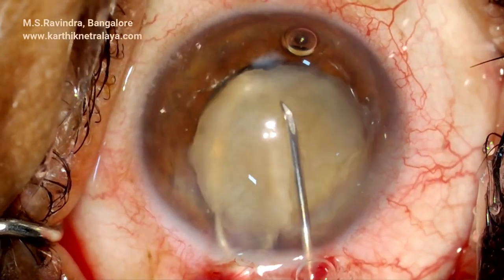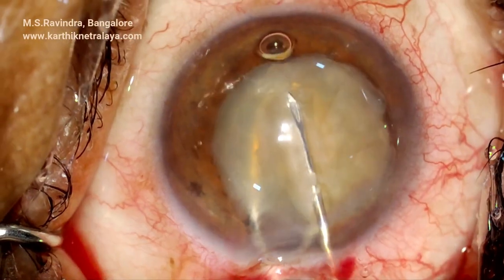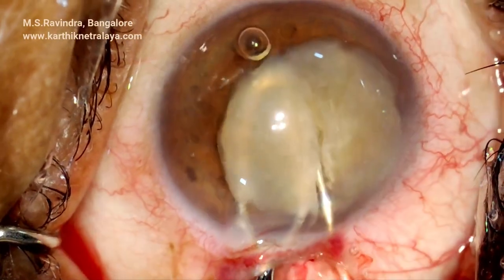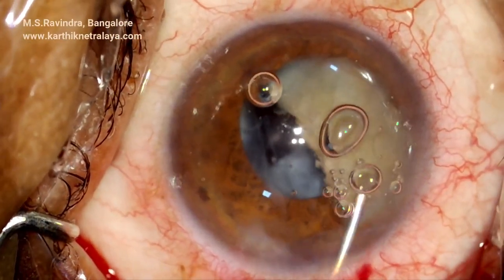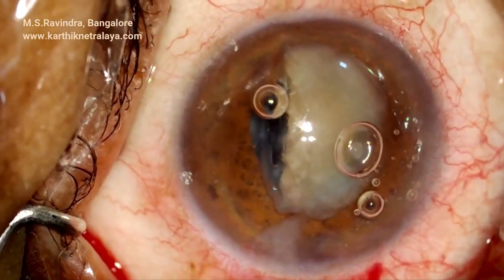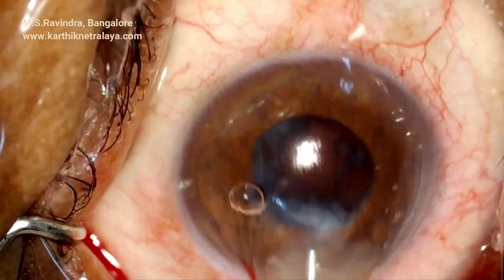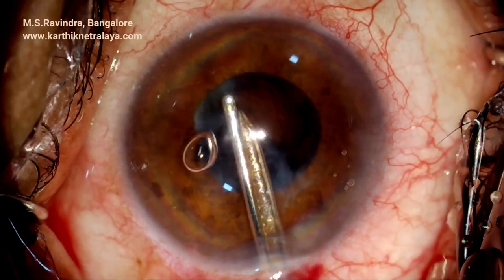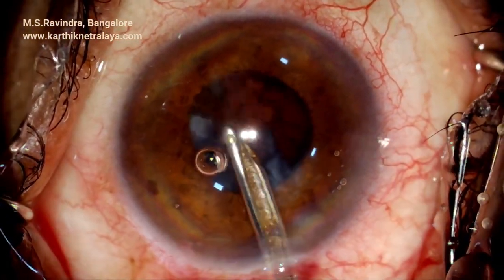Bisection is not happening because of the hardness, so a 45 degree bent cystitome is used to score the nucleus. The cystitome is mounted on a 2 cc luer lock syringe filled with viscoelastic, and the viscoelastic is continuously infused in front of the nucleus — initially through the cystitome and then through the 25 gauge cannula — so the endothelium is well protected.